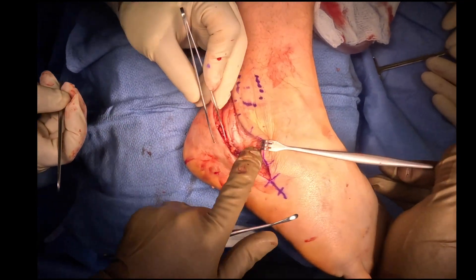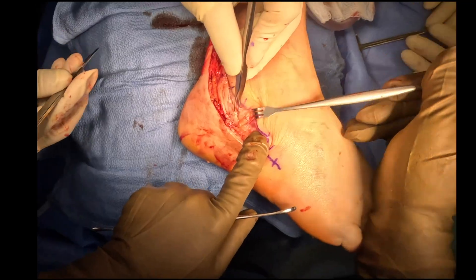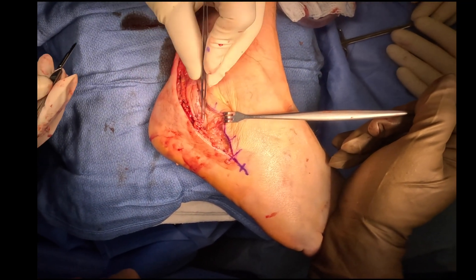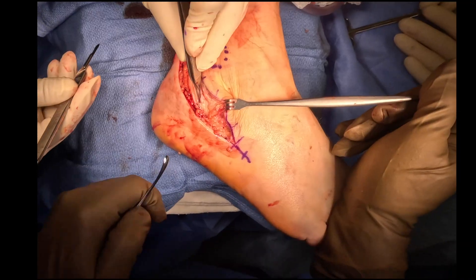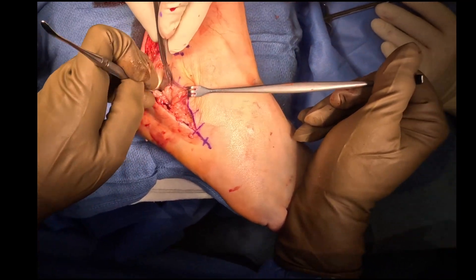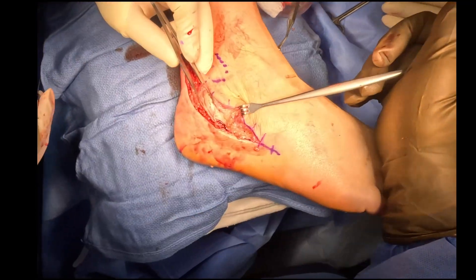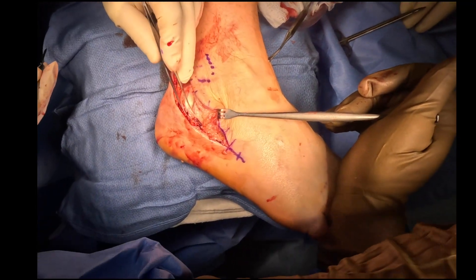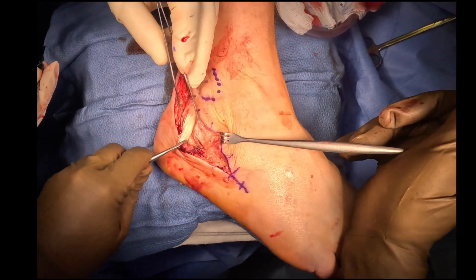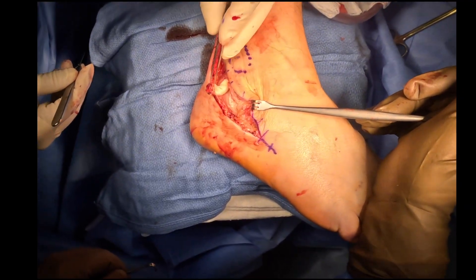In this video, we're demonstrating a repair of the peroneus longus and the peroneus brevis tendons that course behind the ankle. This is a 52-year-old patient that has sustained an injury to these tendons, and the MRI demonstrated both a longus tendon as well as a brevis tendon rupture. There was a partial rupture of the longus noted on the MRI and some longitudinal tearing of the brevis tendon, but intraoperatively, we found a complete rupture of the longus and almost 90% rupture of the brevis.